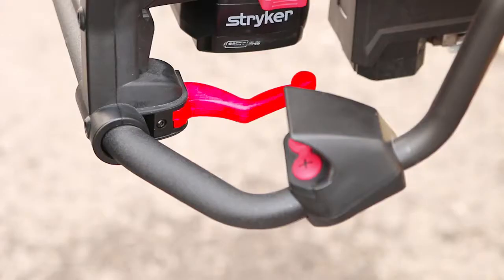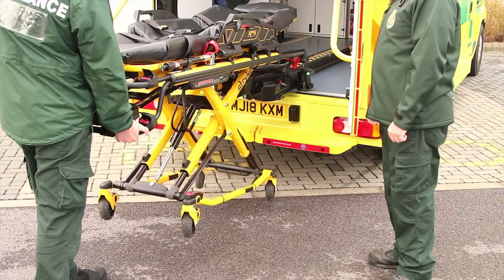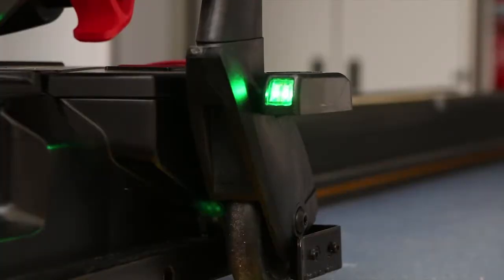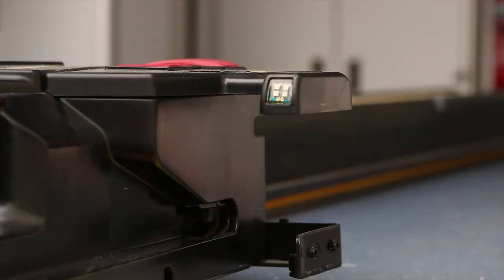Locate the red manual override release lever on the stretcher. Squeeze the red manual override release lever until the legs touch the ground. Locate the control panel on the PowerLoad and press and hold the down arrow button until the lifting arms are completely lowered. The LED lights on the PowerLoad will be solid green, indicating the stretcher can now be disengaged. Lift the red manual release handle on the back of the PowerLoad to unlock the stretcher; the LED lights will then flash amber.